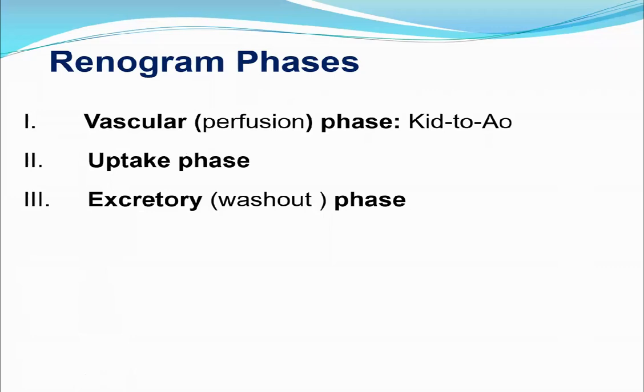We must put in mind that there is no pure uptake phase and pure excretory phase, but excretion occurs in the uptake phase and uptake occurs in the excretory phase. But in the uptake phase there is uptake predominance, and in the excretion phase there is excretion predominance.